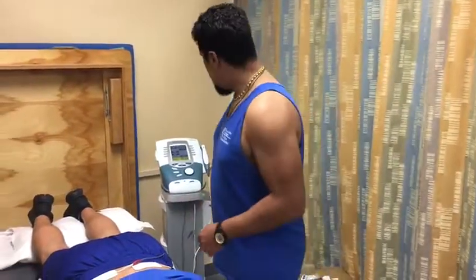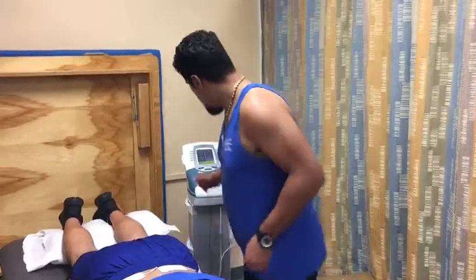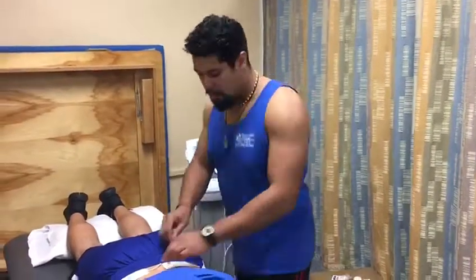10 minutes later, all right, the machine has turned off. Take off the leads. Take off the electrodes.